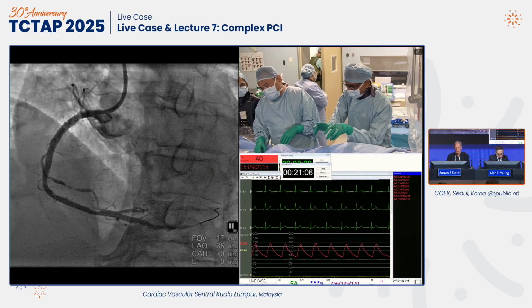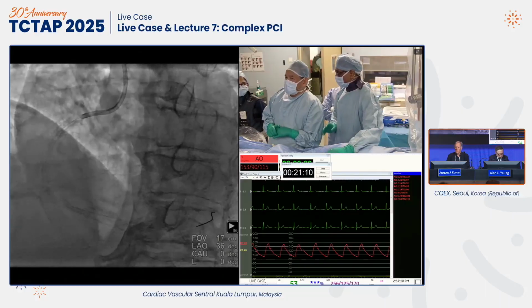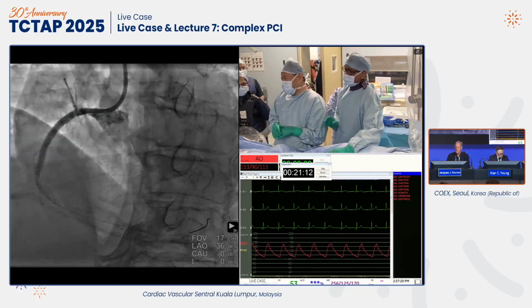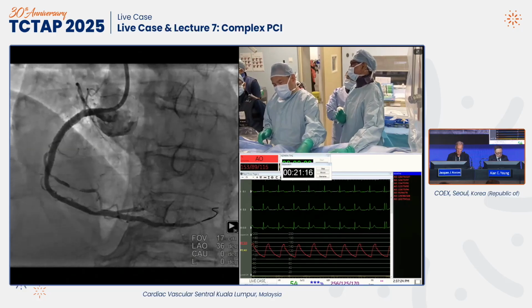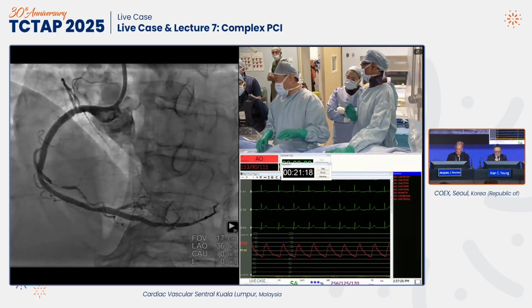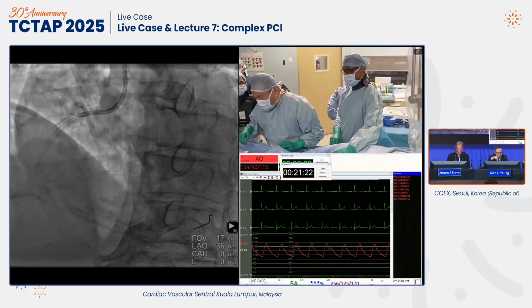Having said that, the caveats are that at the moment there is no recommendation for use in ISR lesions. And the recommendations are also not to go beyond 12 until you have done enough and you feel comfortable. And you didn't hear it from me. I didn't say more than 12.